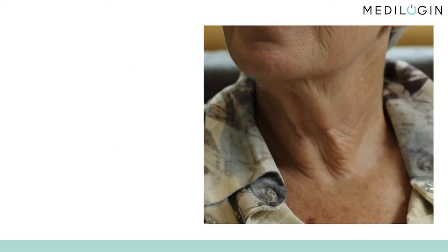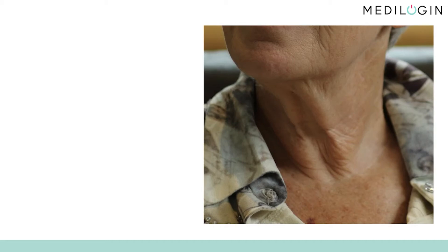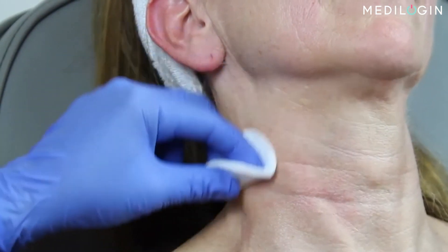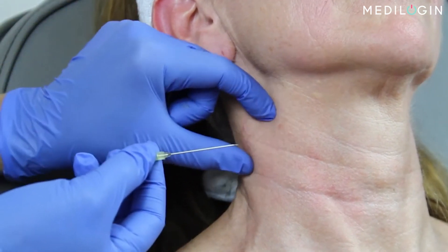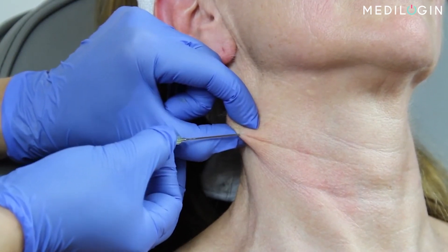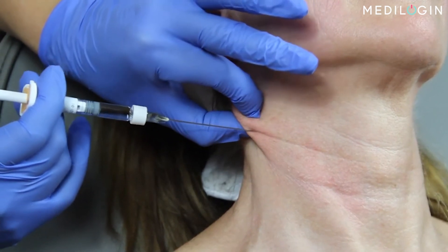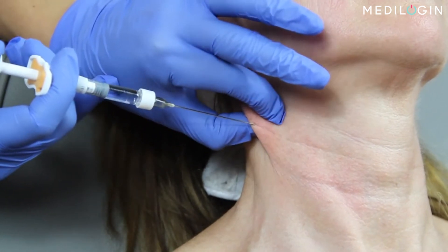In this lesson, we'll go over the aesthetic treatment of the neck using hyaluronic acid. The goal here is to smoothen small horizontal wrinkles. Begin by thoroughly disinfecting the area to be treated. Grasp a fold of skin and create an entry port using a sharp needle. Then switch to a blunt needle, and carefully insert it along the groove of the wrinkle. Advance gently, as a small amount of resistance is normal.